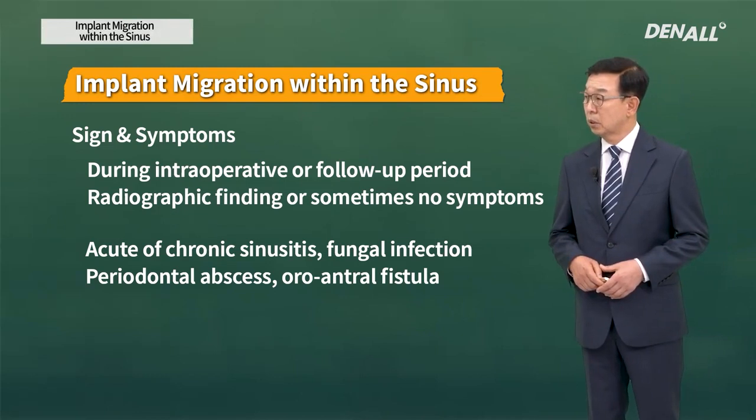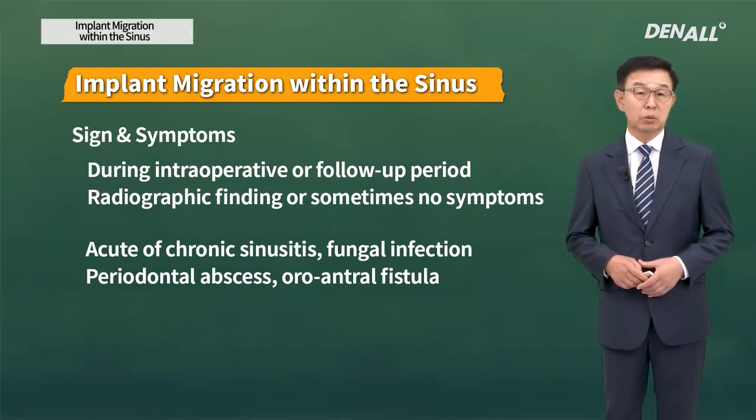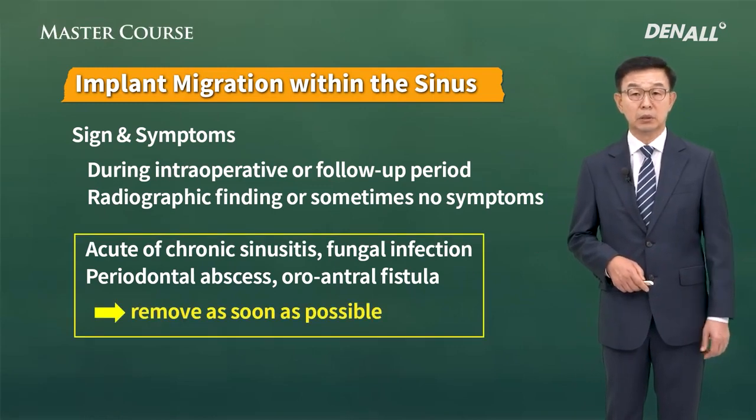Therefore, when you do a crestal approach or window approach, you need to do regular checkups, and if the implant has migrated into the sinus, as soon as possible, you need to remove it.